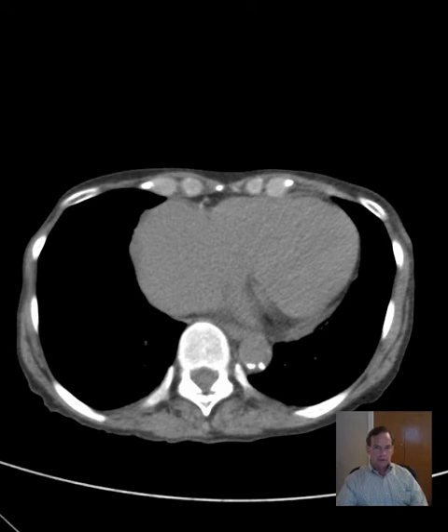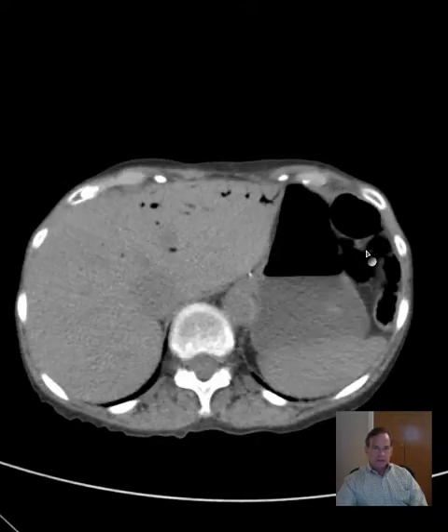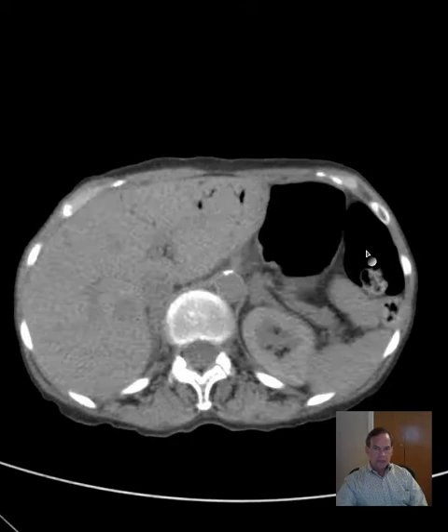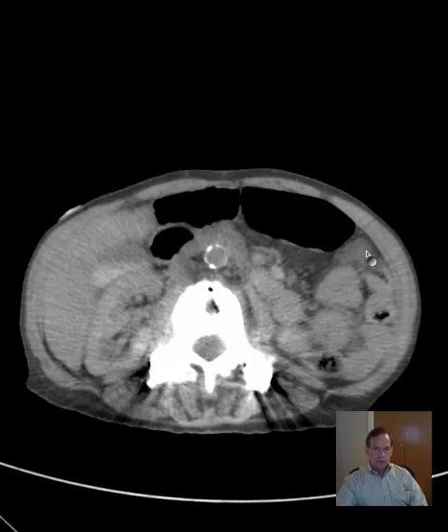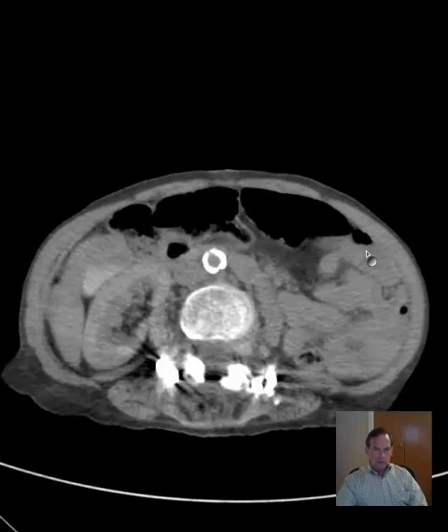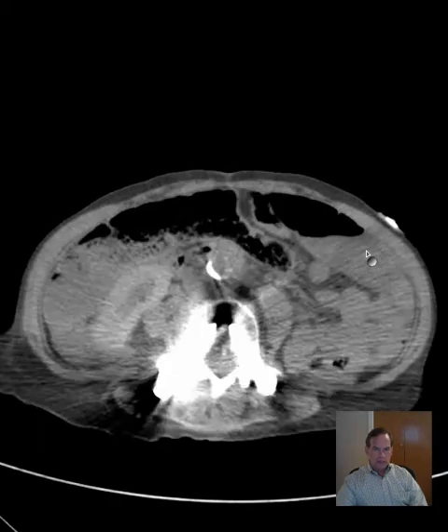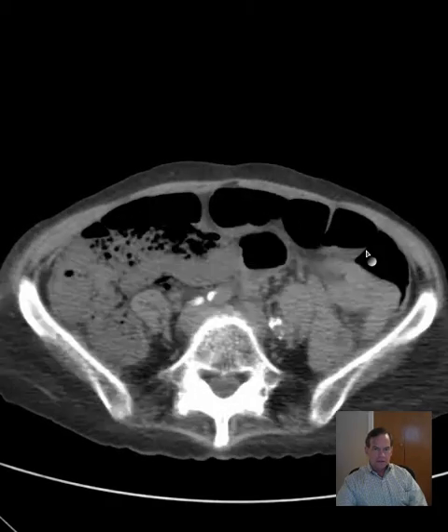Hello there, this is Dr. Mintz. This is a patient who presented to the emergency room with abdominal pain. A CT was performed — CT abdomen and pelvis — without oral or IV contrast.